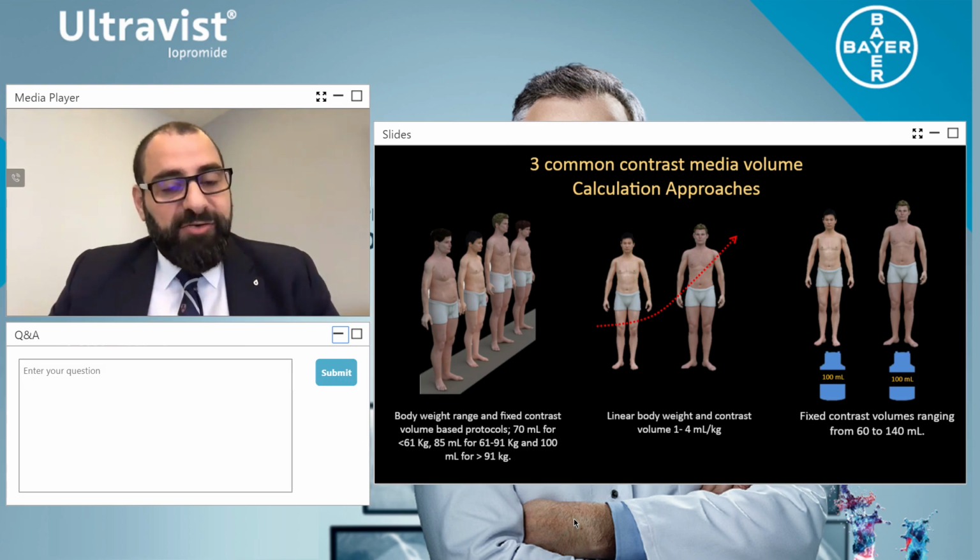And there's another school of thought to say, well, how can we reduce this? People are saying contrast media volume reduction. I don't agree with this. I tell you, the biggest issue we're facing today with renal safety is because patients are dehydrated. So if you're dehydrated and you have a high concentration of urine in your actual kidney system and you're injecting contrast, this is where the issues occur.